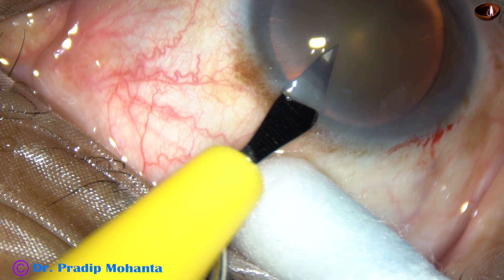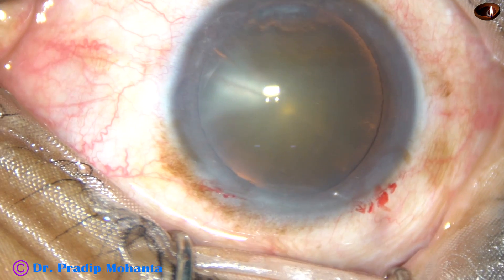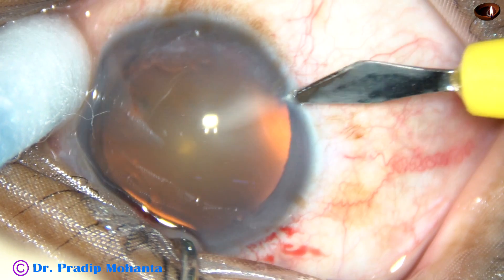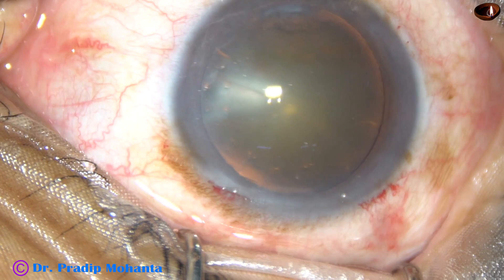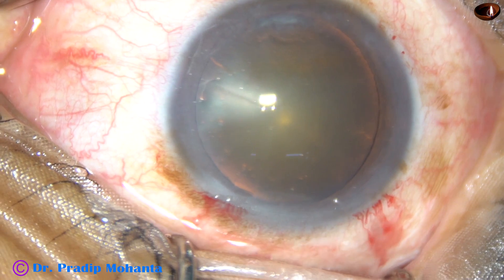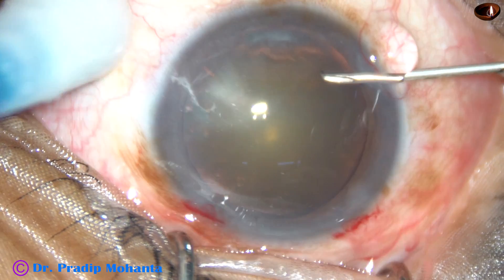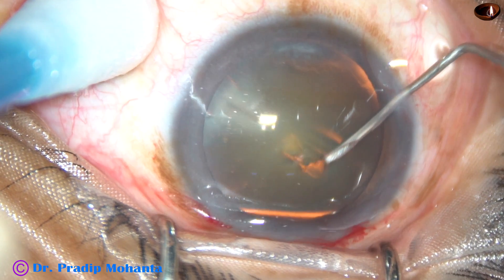This is a side port. This side port should be mid-limbal. Always make the incisions involving capillaries. If you involve the capillaries, healing will be very good and chances of infection are reduced. And now see how the rhexis is being done.